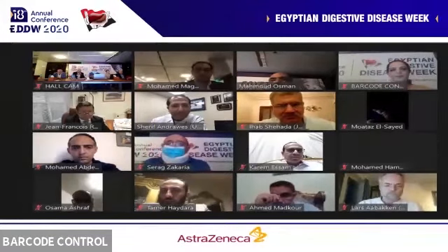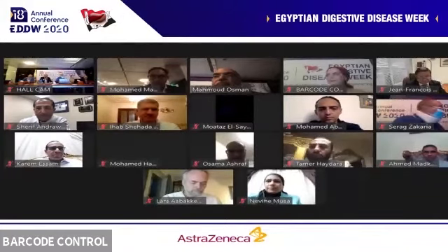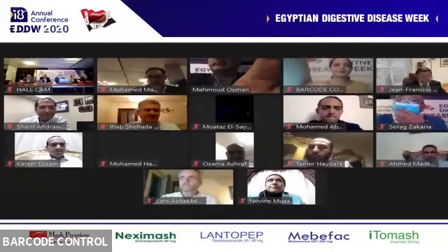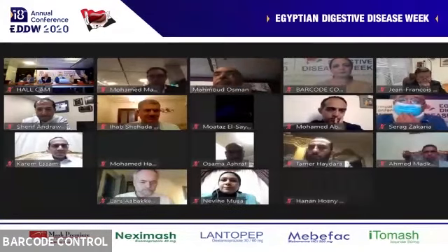Thank you, Professor Andraus. It was a lovely presentation, and you put it so clearly, and you make it seem so simple. I'm sure it's not that simple, but thank you. I think this is the best way to describe the technique of POEM. So thank you again very much.